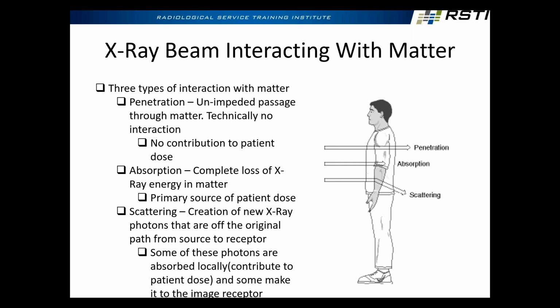Yeah, he's a really talented guy, did a whole lot of fluoro work, and instead of putting a line pair phantom in there, he just put his hand in there. Well, looks pretty good. A couple of adjustments. Right? Like, what are you doing? It's like, it's just a couple seconds. It's like, yeah, but it's a couple seconds. How many times a day? How many days a week? For how many years?